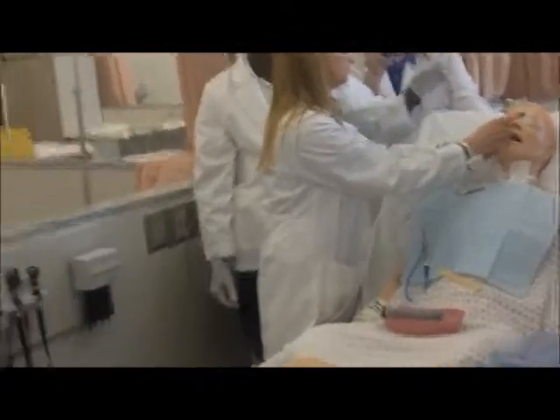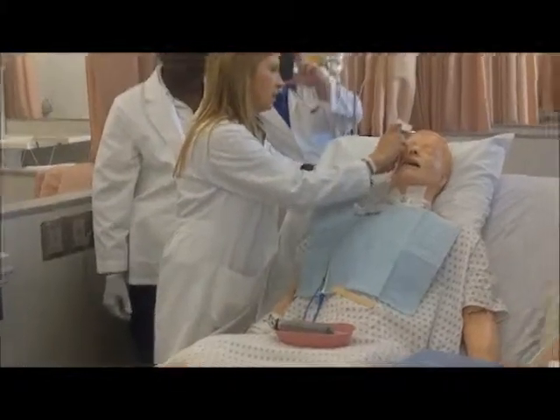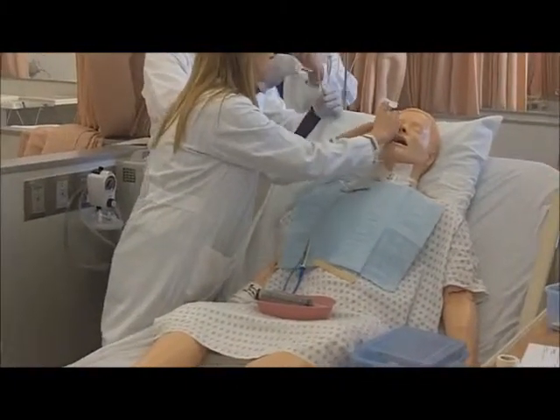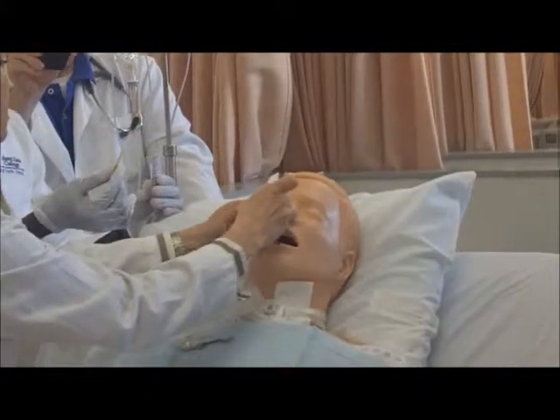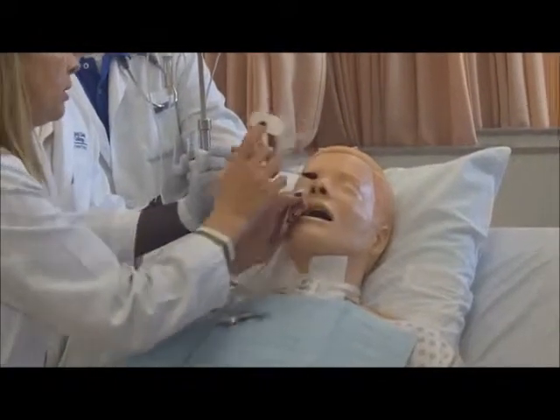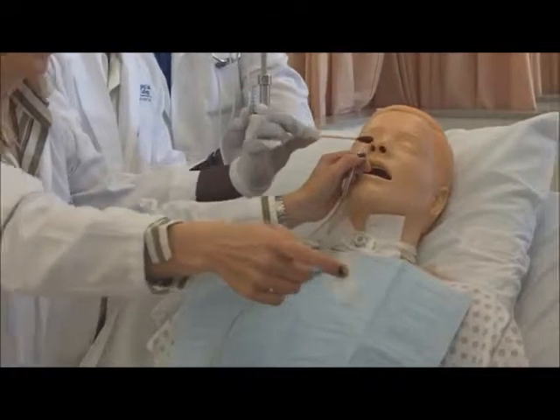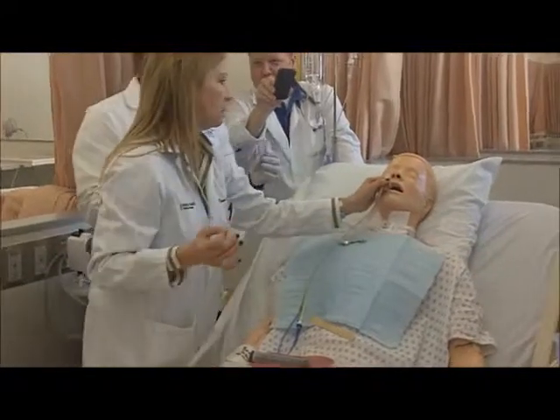You've actually gone pretty good. And they said after you actually place the NG tube, you can either measure the distance. Here, go ahead, can you put a little bit on his nose? Where? Usually just a little bit on the top. Usually when I'm with my patients, I just kind of paint the tip of their nose. And then you want to go ahead and grab your tape. Does it have to dry? Or the whole nose, whatever.